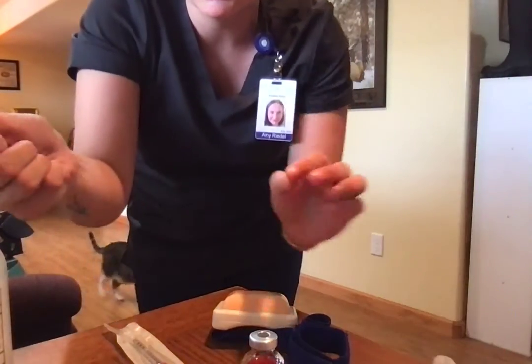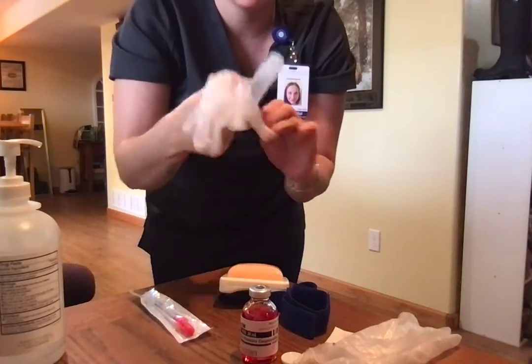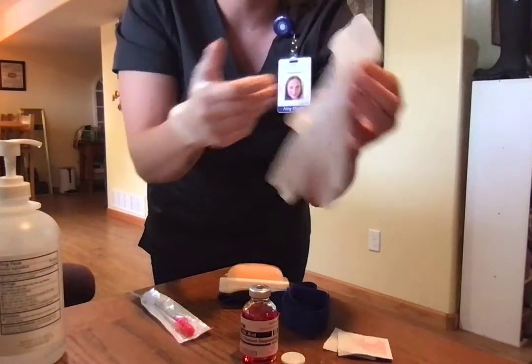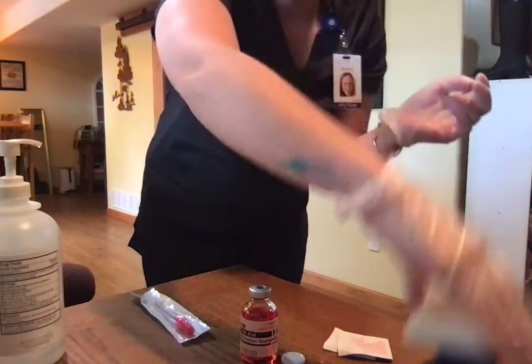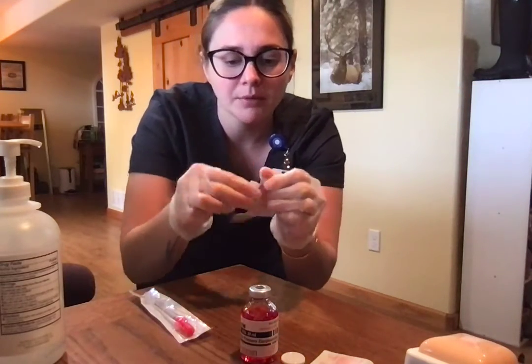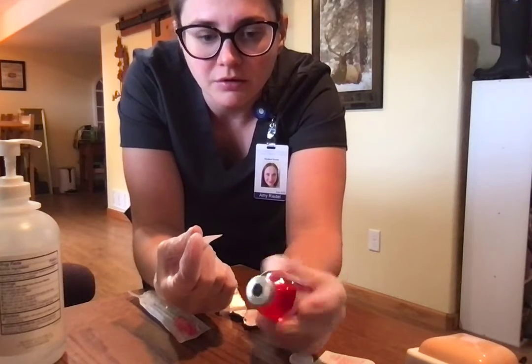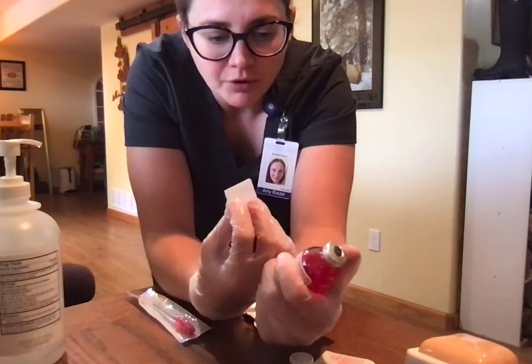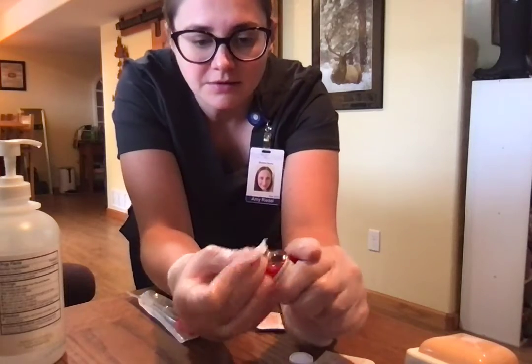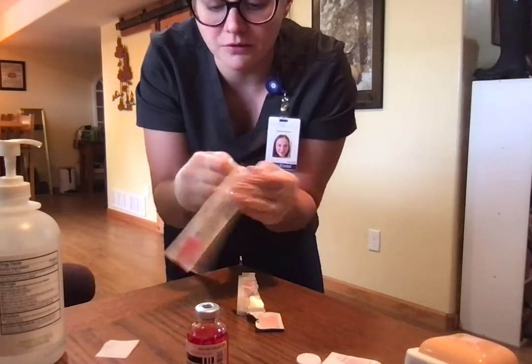So I'm just going to go ahead and put my hand sanitizer on, and put my gloves on. And grab my first alcohol wipe, and we're going to make sure when we check our bottle, because this is a multi-use vial, that you know what date it was opened and that it's not expired. Also, if you're just opening it, write the opening date. So we're just going to clean the top with the alcohol and open up the syringe and needle.